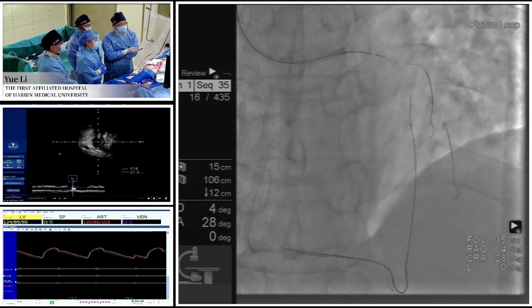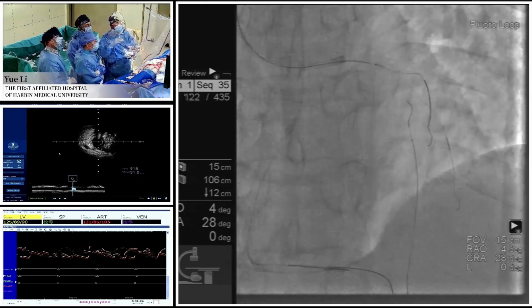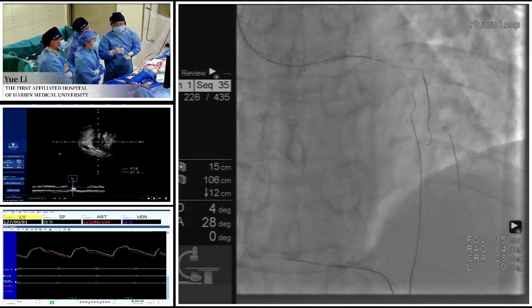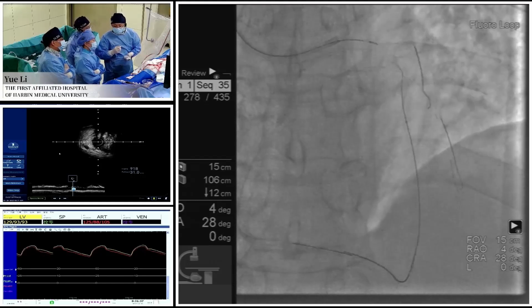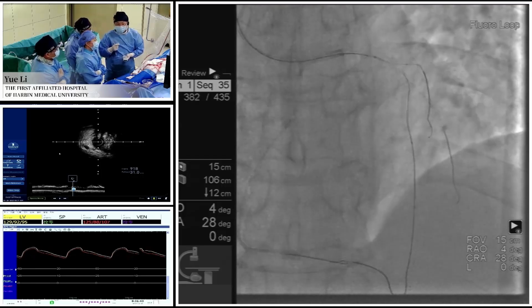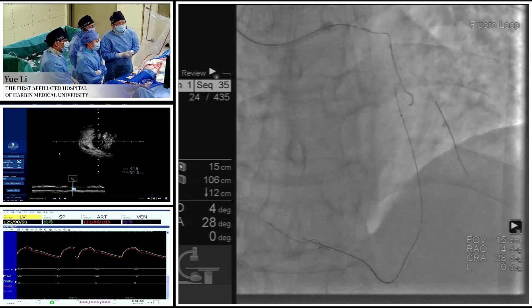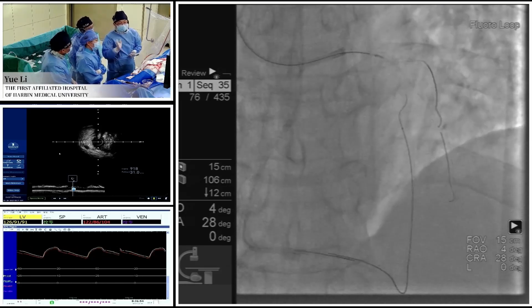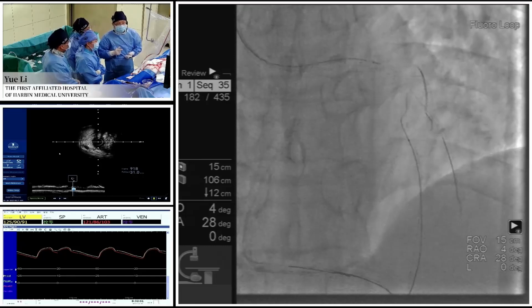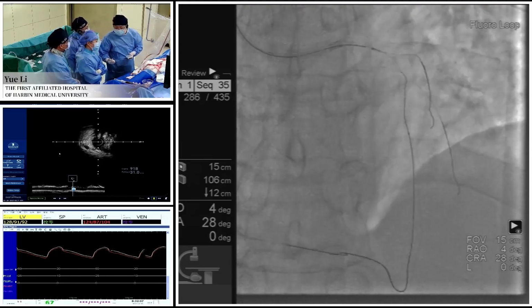We should advance an antegrade wire with the guide of the IVUS to make the retrograde wire escalation at the occluded segment. But for this case, because we already know it's a very soft plaque, the IVUS visualization still gave us some guidance. So this time we directly use the retrograde wire to go through. But one very important key point is we should use antegrade IVUS to check the retrograde position, where the reentry point is.